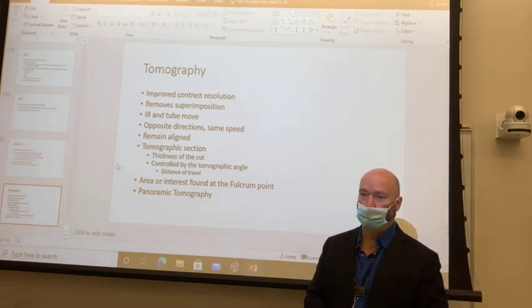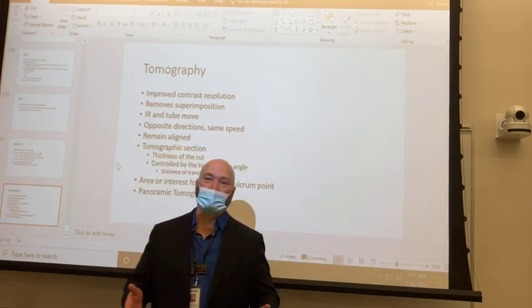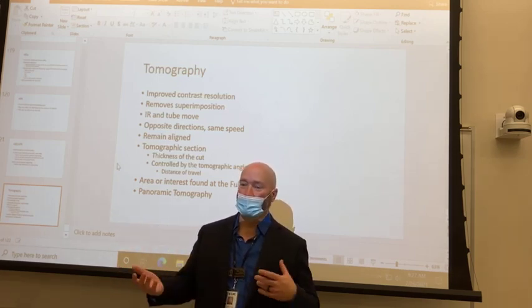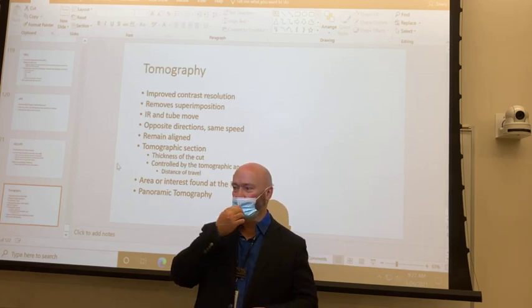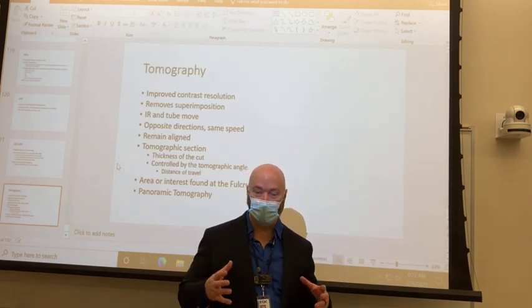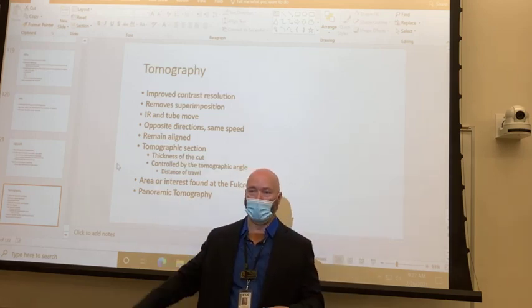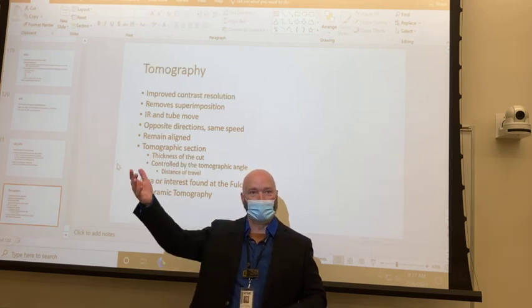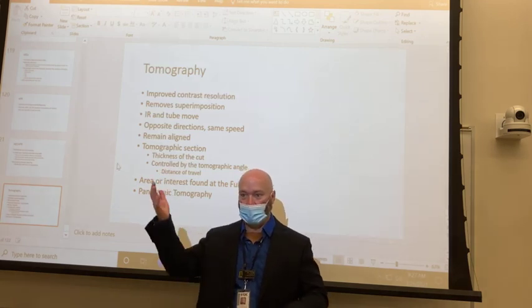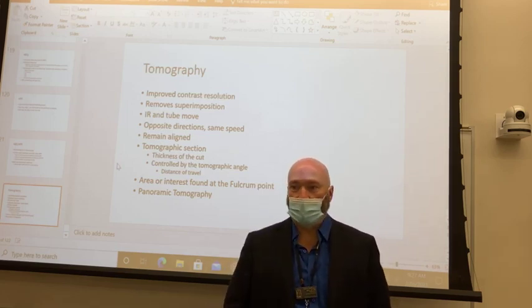Whenever you were talking about index number, is index number another word for the S number? Yeah. I use index number because not all manufacturers use S number. They have different names for it. Now, that's something that I really think there should have been an industry standard for, because some use a scale of 1 through 4, some use 100 through however high. And some, if the exposure is too high, the number is low. Some, if the exposure is too high, the number is high. There's no consistency. So the S number is an exposure index number? Yeah. Okay, got it.